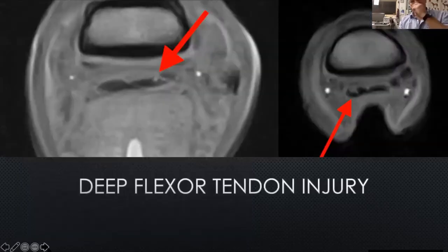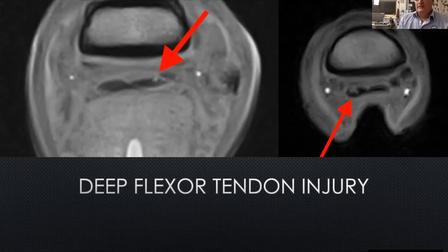This next case is a transverse slice. The deep flexor tendon that runs down the back of the pastern and into the foot is a bilobed structure with two black elliptical areas. One is a perfect ellipse, the other has a little white spot — that's a tear on the front surface of that tendon. Over on the right, it's a lot more obvious: one side of the tendon is perfect, but on the other side there's a big hole in the tendon just above the level of the navicular bone.